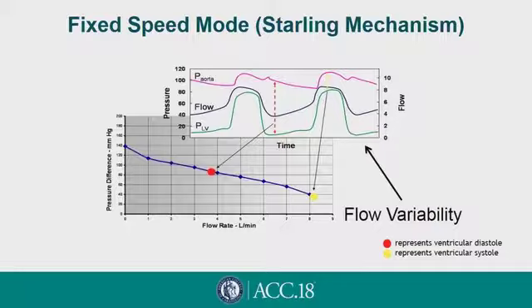So when differences in pump pressure change during the cardiac cycle, during diastole, when there are large differences in pressure, flow is less, and during systole, when pressure differences are less, flow is more. Now, you could add preload. If you increase your preload, you will see more flow with the pump, and if you reduce or increase your afterload, you will see more or less flow with the pump.